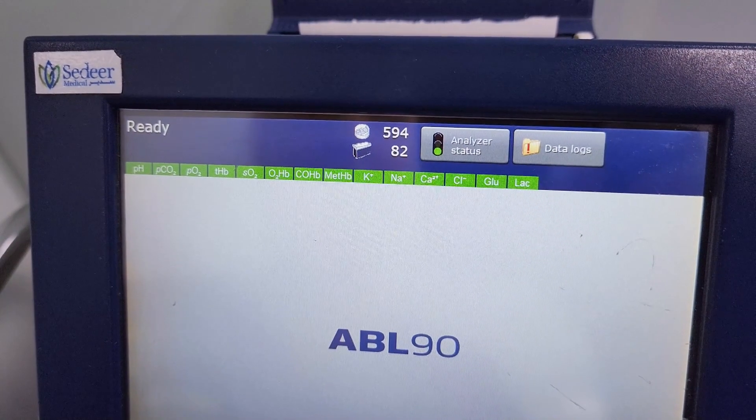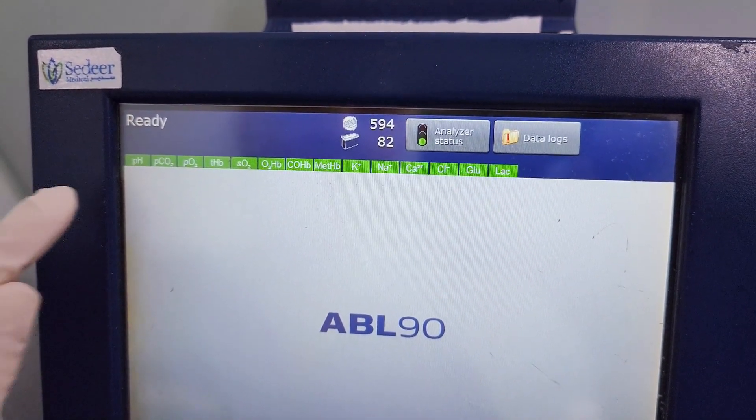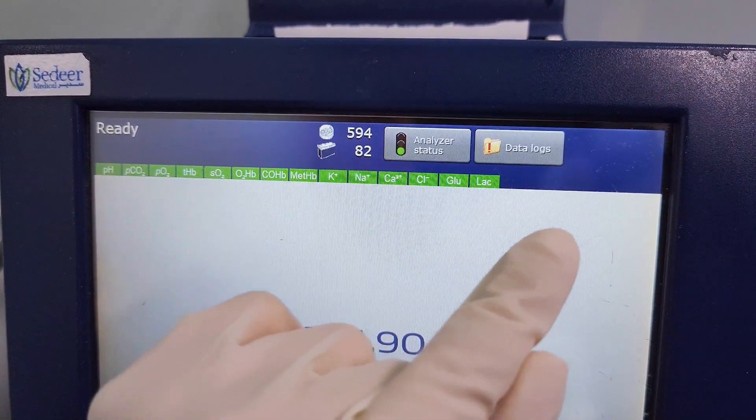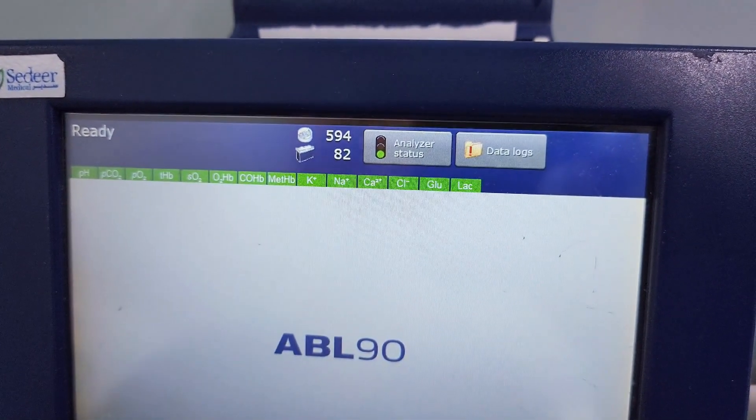The analyzer is ready for use when three conditions are met. Make sure that the message on the top reads ready, the color of the tab parameter is green, and the color of the traffic light in the analyzer status button is green.